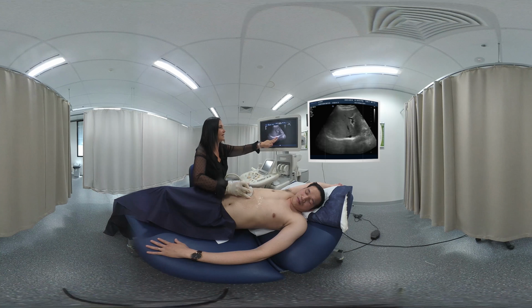So if we were worried that that was an acute gallbladder, we could actually push in and let go and just ask if there was a pain response, or look for a pain response. Now, I know that that's quite a chronic problem because there's no rebound tenderness, or there's no pain upon letting go. So where probe pressure causes pain is a positive Murphy's, okay? So just be warned of that when you're looking at pathological gallbladders. Now back to the liver.